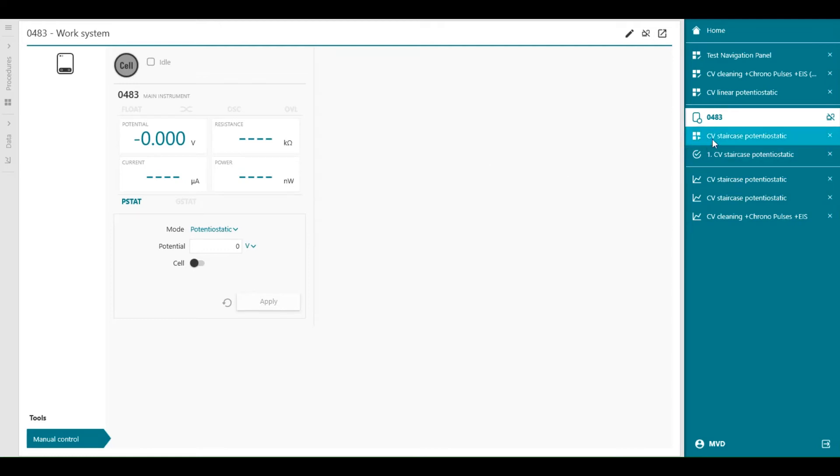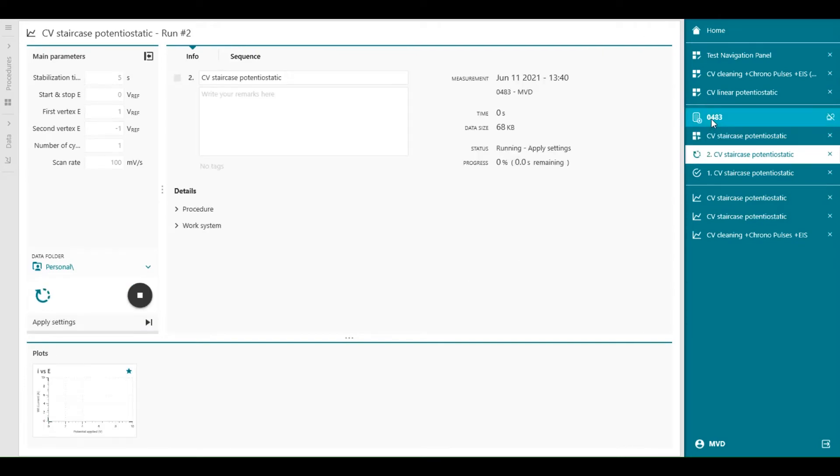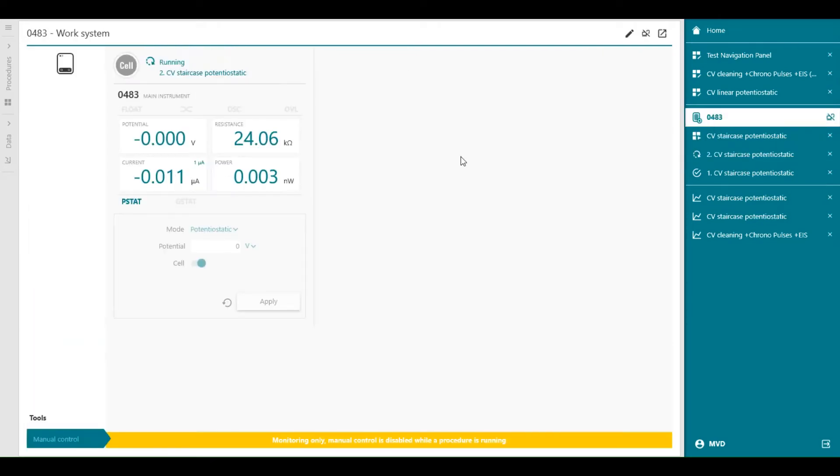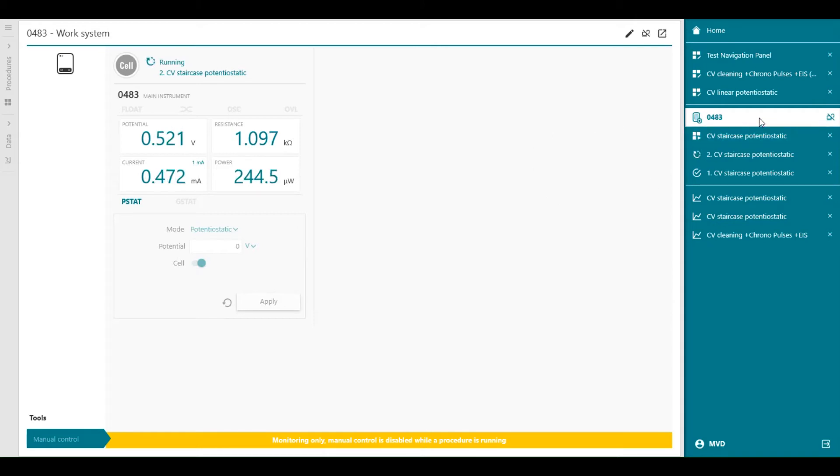So I can start it again. Press start. And when I open, you'll see that the icon is pulsing with a heartbeat. That means that this work system is executing a procedure.